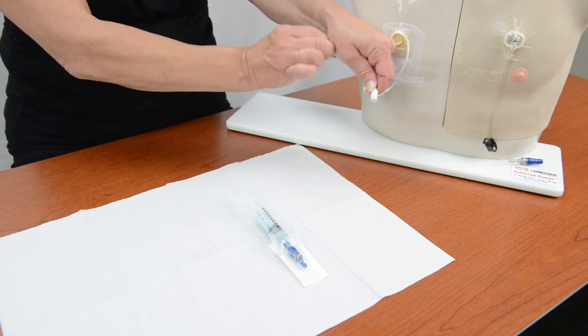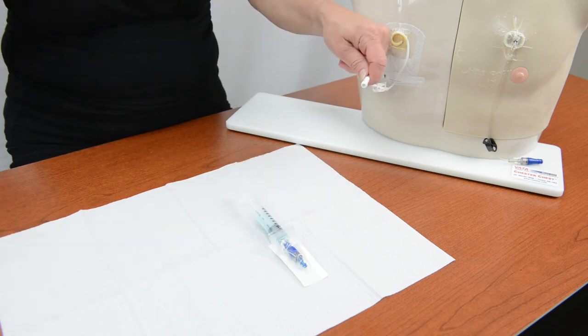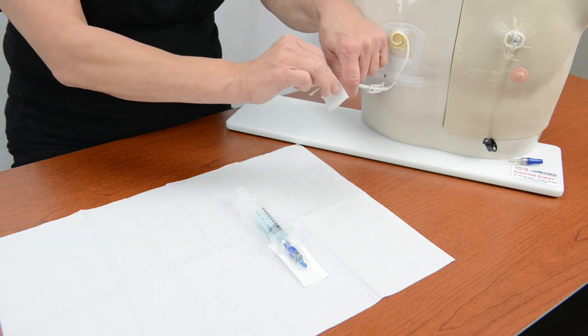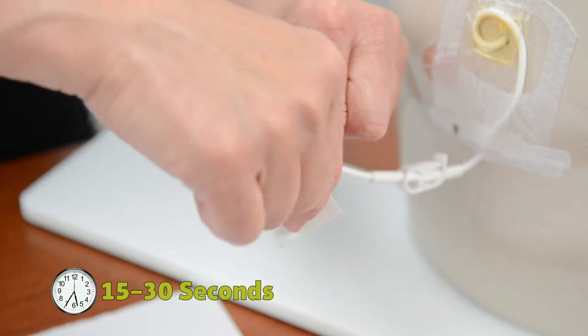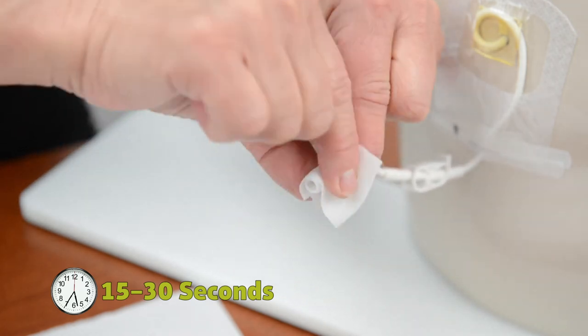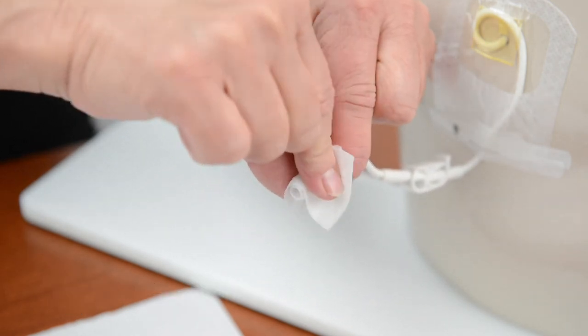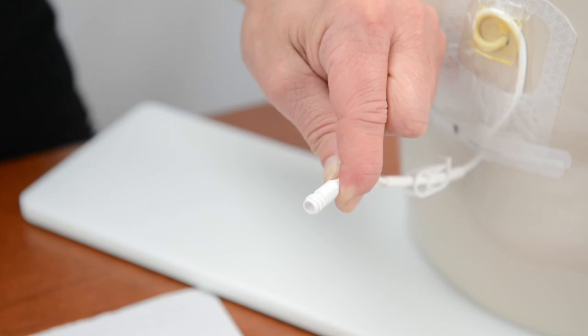Open the third disinfecting pad. Wrap the pad around the open end of the catheter. Do not touch the open end of the catheter with the pad. Scrub with a twisting motion for 15 to 30 seconds. Let the area air dry. Do not fan or blow on it.